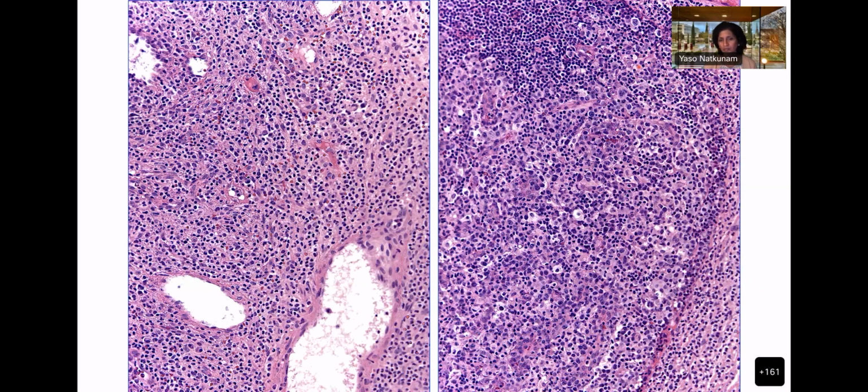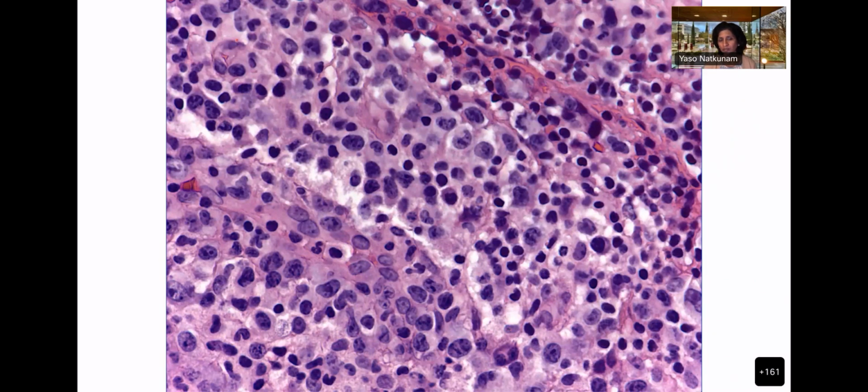Even higher magnification. Do the histiocytes internalize some cells? I don't think so. I don't think there's emperipolysis or hemophagocytosis here, if that's what you're getting at. I have another example I can show you, but yeah, so lots of cytoplasm. Do the nuclear outlines bother you?